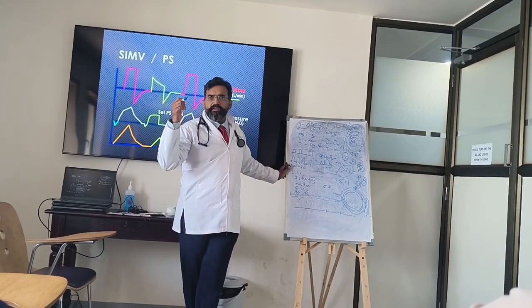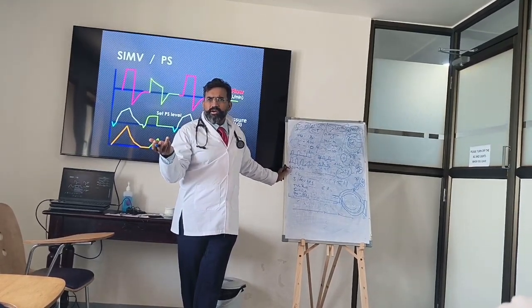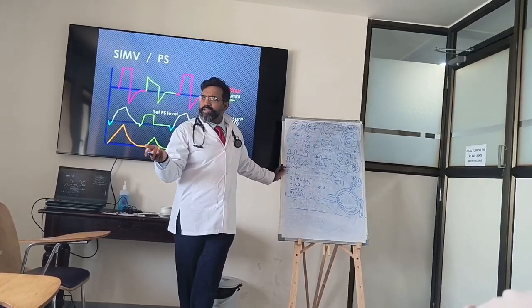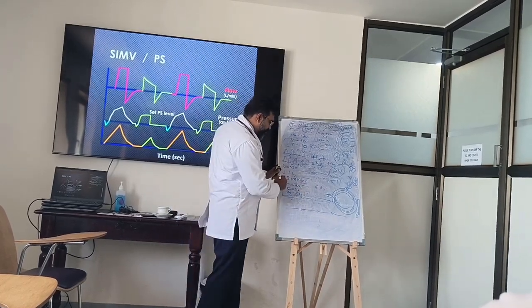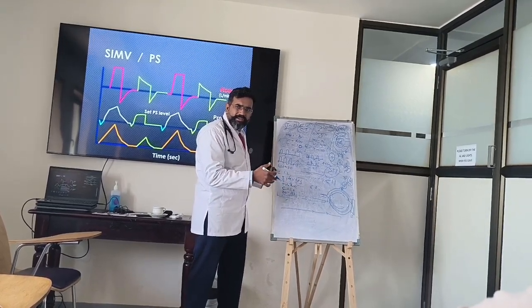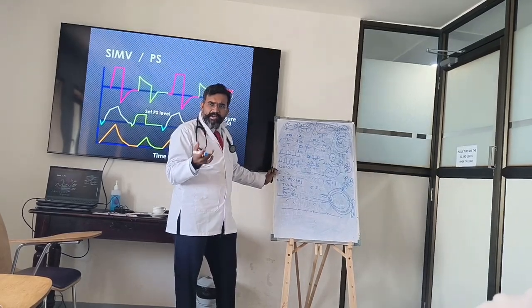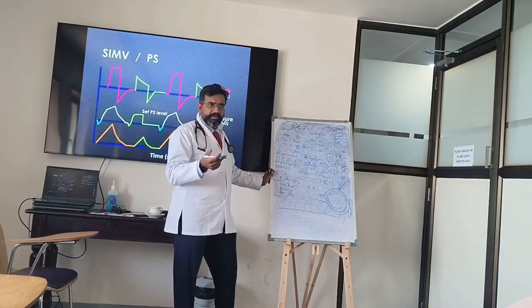So if I paralyze a SIMV patient, it's going to be assist control. And if the patient is not taking a breath, it becomes control mandatory ventilation. Clear? Am I clear till now? I'm setting the trigger also here as -2. So if I paralyze, this becomes just normal mechanical ventilation, no trigger, nothing. Time cycled, flow, volume limited, and cycled by time. It's triggered by time. If the patient starts getting triggered, it becomes patient trigger.